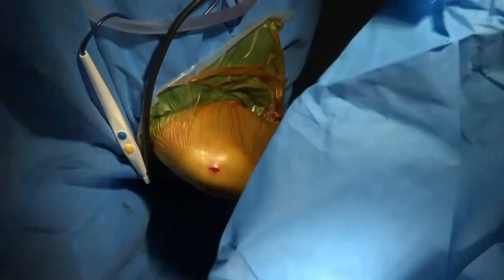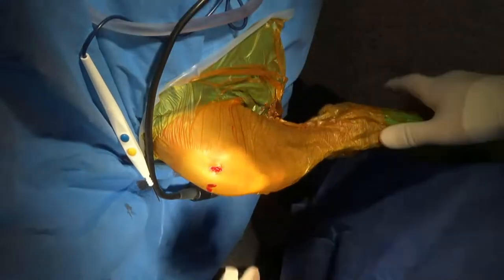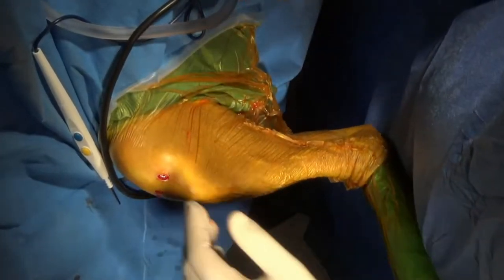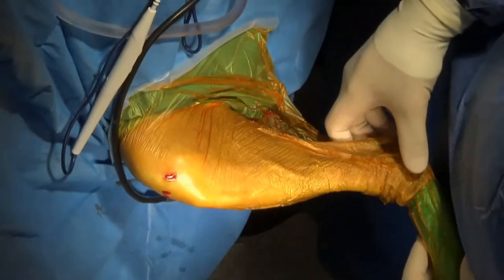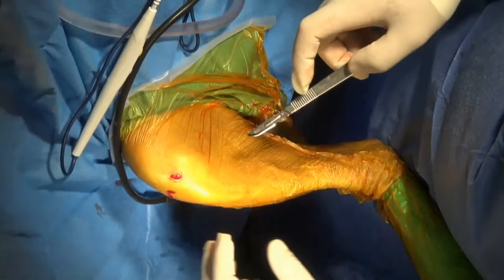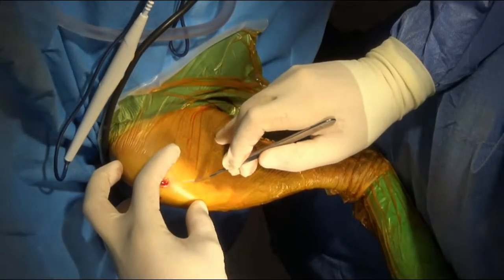Thank you. So we're just getting a few instruments and everything set up, and then we'll get started. Say that again, Ewan. Oh, yep. So we'll get started. Ewan's going to get a few things set up. I'm going to start our approach here. Similar approach to when we do a TPLO, it's just a medial approach onto the proximal tibia.